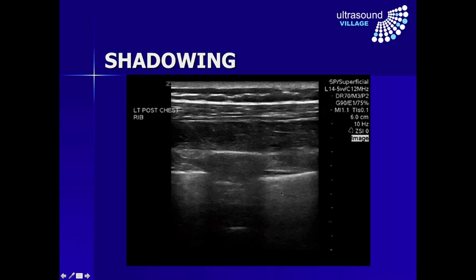Both interfaces — tissue-bone and tissue-lung — will cause shadowing. However, you might notice that one is a darker shadowing and this one has some brighter echoes behind it. So if all of the energy is reflected back, why isn't this a neat black area? We're going to talk about other artifacts that create this difference between what happens at an air-tissue interface versus a bone-tissue interface.